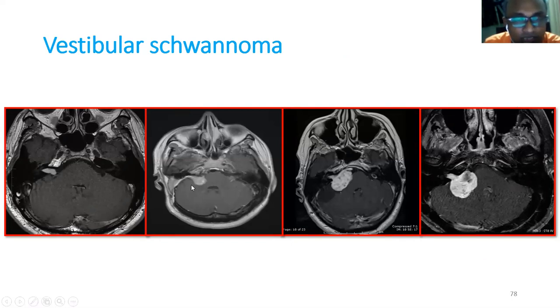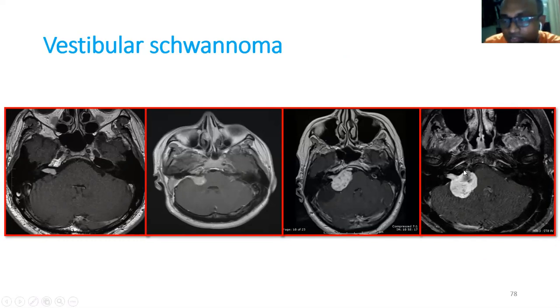The ice cream cone appearance is typical of a slowly growing vestibular schwannoma. In a larger lesion, heterogeneous enhancement is seen. The intracanalicular part cannot be differentiated from bone on CT, making MRI essential. The CISS or FIESTA sequence clearly delineates the intracanalicular component.